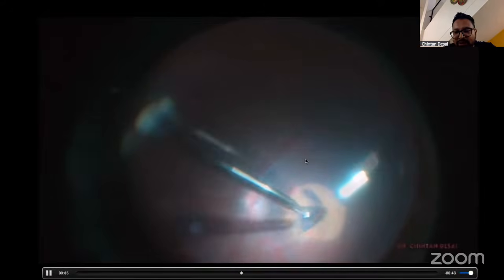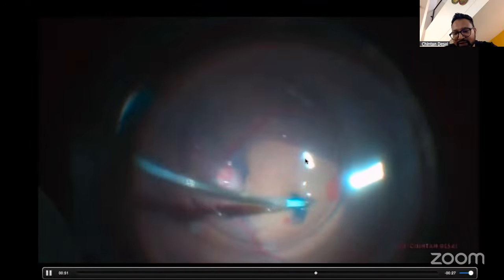So after making these multiple flaps, I try to make smaller flaps now because I don't trim them anymore. So the size of the flap is not very large, and the remainder of the ILM is removed. Now I inject the PFCL, not before. I'm not peeling the ILM under PFCL, but I'm just injecting the PFCL bubble and keeping it in contact with the flap for probably 30 seconds or so.